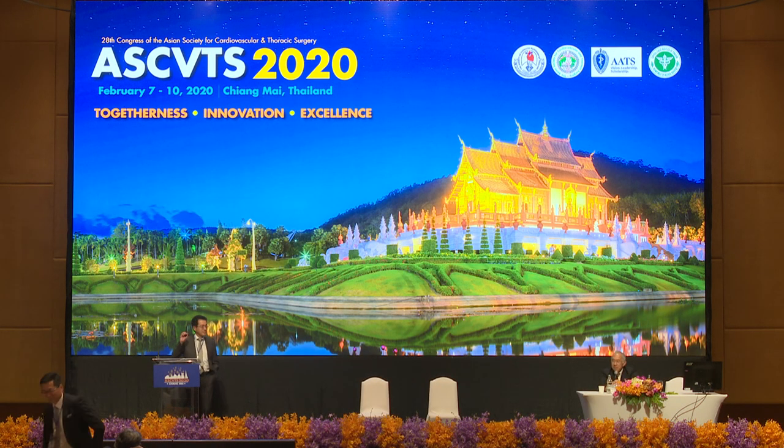Okay, so if there are any more questions, Dr. Takemura. Thank you very much, Professor Yokoyama. Regarding the IABP, in my experience, IABP is not always safe, and I prefer the pump rather than IABP for bad deterioration of the hemodynamics.